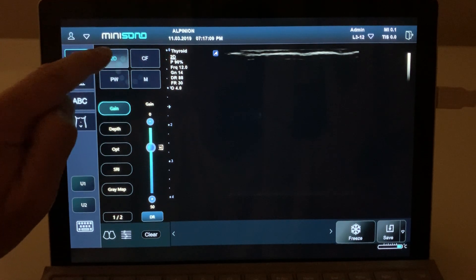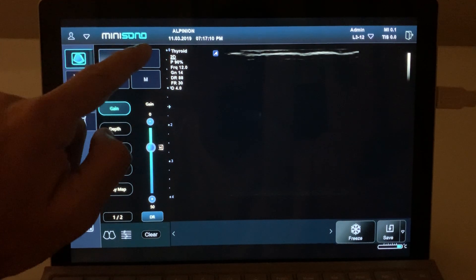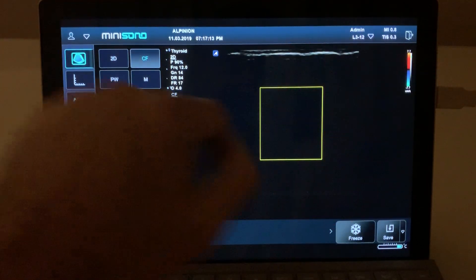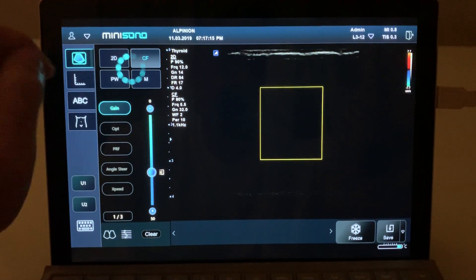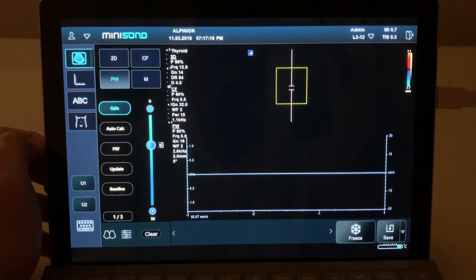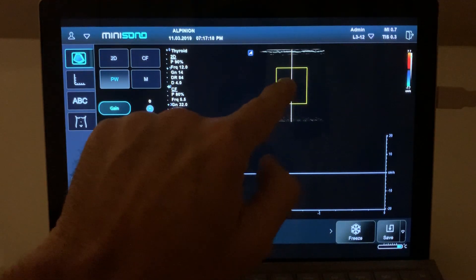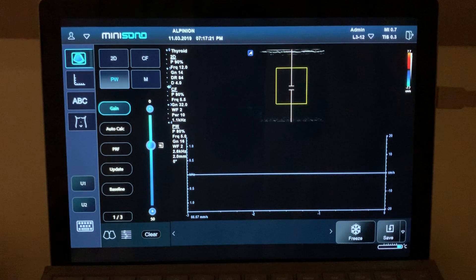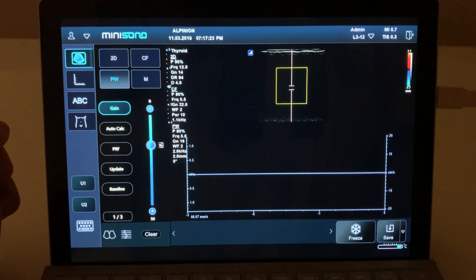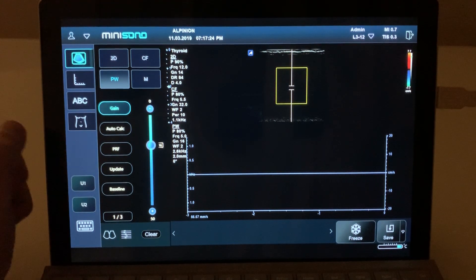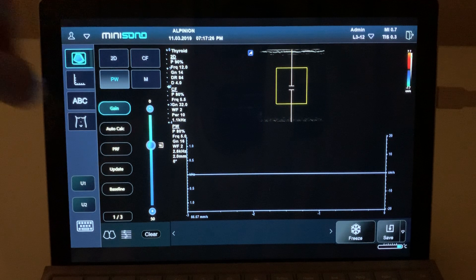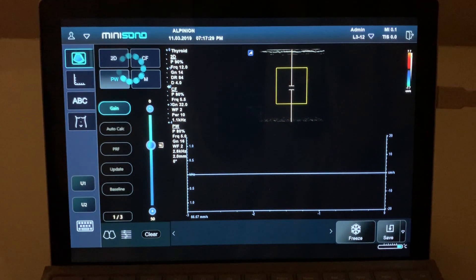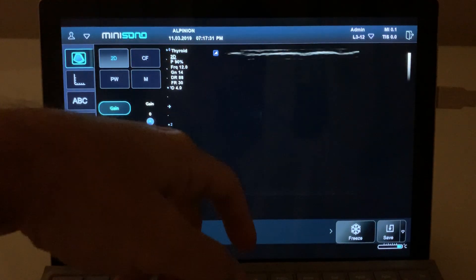Then we have the image modes. The main image mode is 2D. It also has color flow — when you select it you'll see the color flow box. Then it has PW — when you click on that you will see the PW gate and the PW waveform. If you want to go back to 2D, click here and you'll see it went back to 2D.